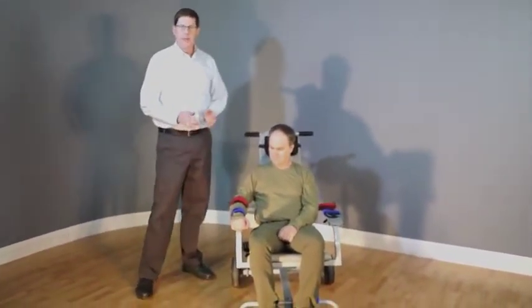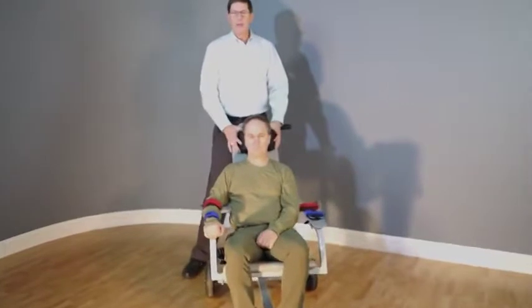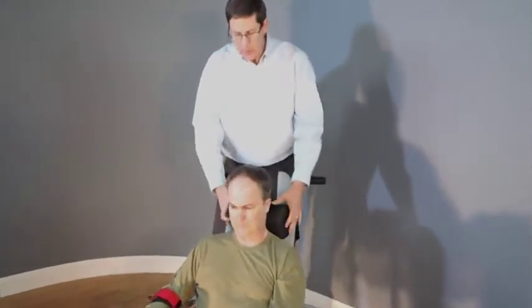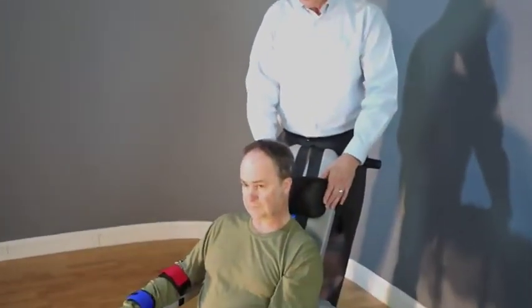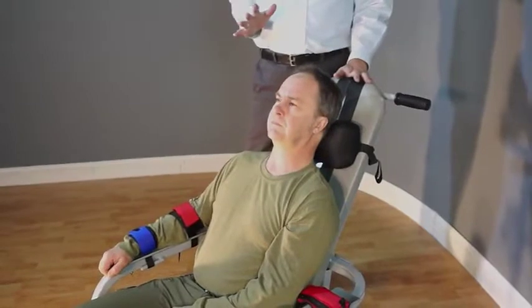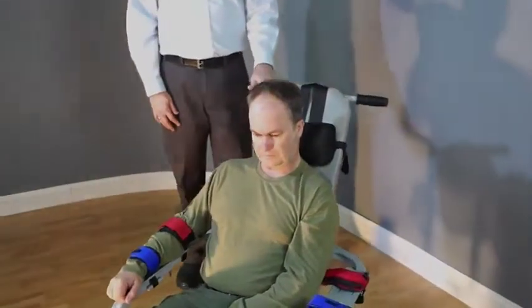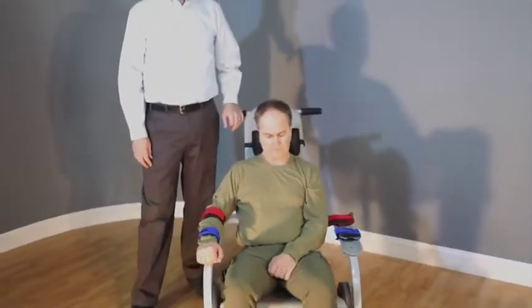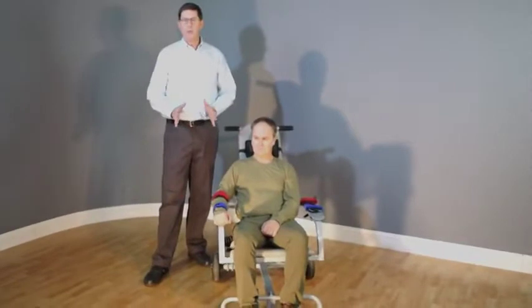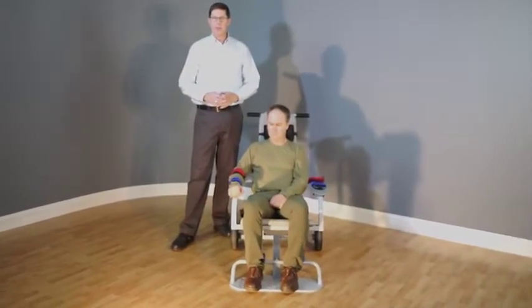The last step — in addition to what was shown on the correction chair — is placement of the headrest. This is a memory foam headrest with elastic straps. Place it where it's comfortable for the person and according to their height in the chair. This provides comfort while they're being restrained and also reduces the chance of injury due to headbanging. That's the last step in the restraint process for the medical chair. If you have any questions, go to our website, send a contact form, or give us a call. We look forward to supporting your efforts in keeping people safe. Thanks for your time today.